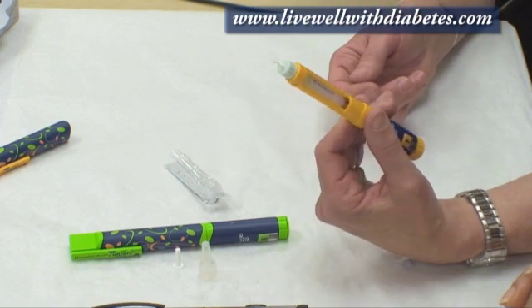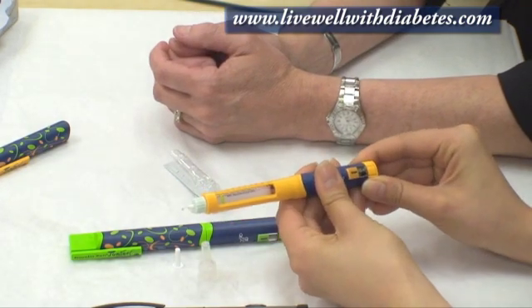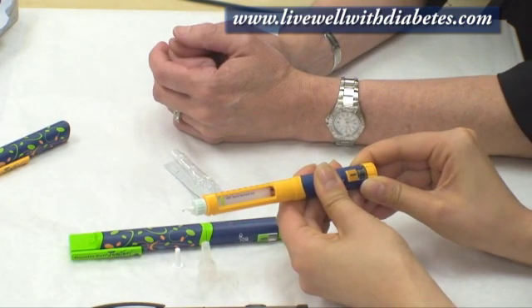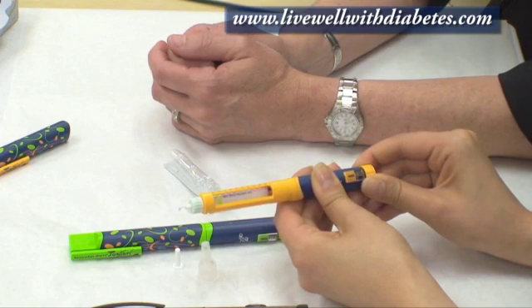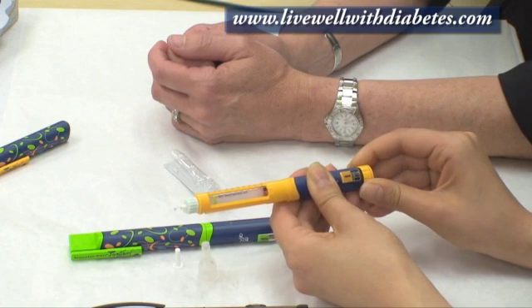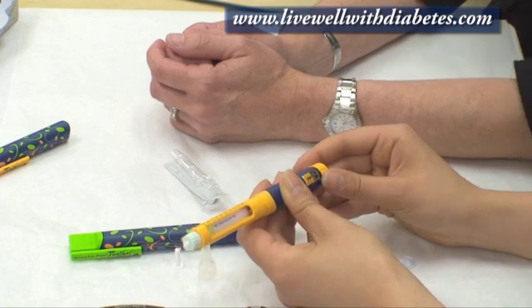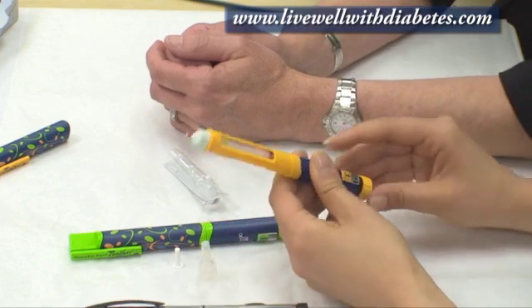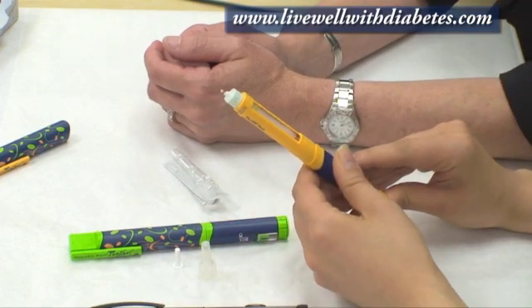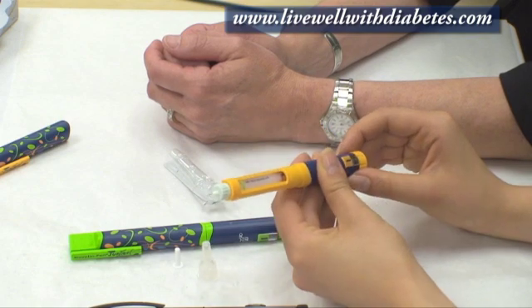Sure, you can try that. It goes by half units — that's right. So that's at four — one more. There we go. And push. That means it's ready to be used.